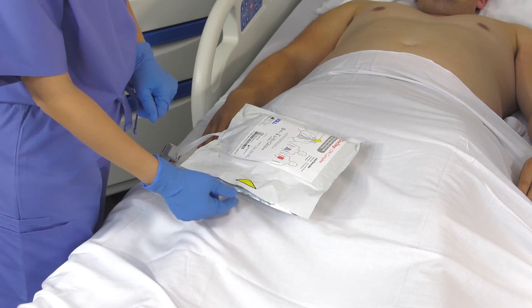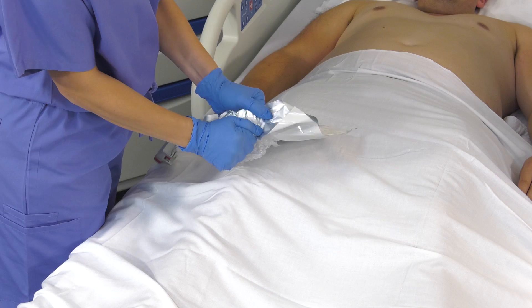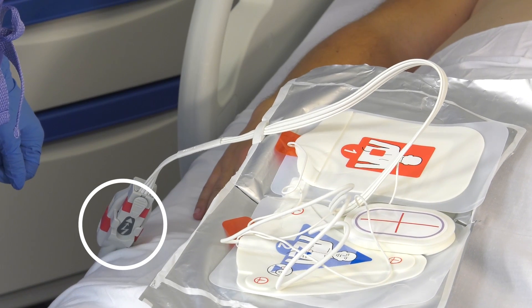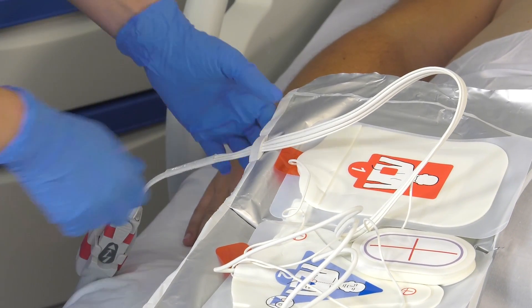To open the one-step electrodes, grasp the electrode packaging at the yellow triangle and firmly pull open, separating the two sides. Notice the one-step cable is attached to the electrodes. Pull the cable up from the package to separate it.